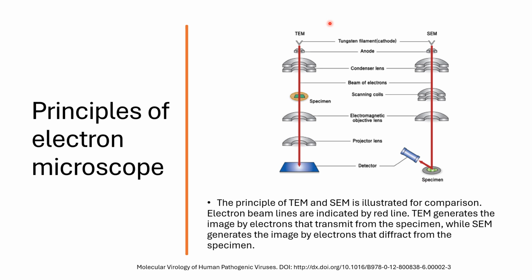What can be learned from TEM images of virus particles? TEM reveals the overall morphology, whether viruses are spherical or elongated particles, and whether they are naked or enveloped. In addition, even symmetric pattern, that is, the T number of an icosahedral capsid, could be obtained from a higher resolution image.